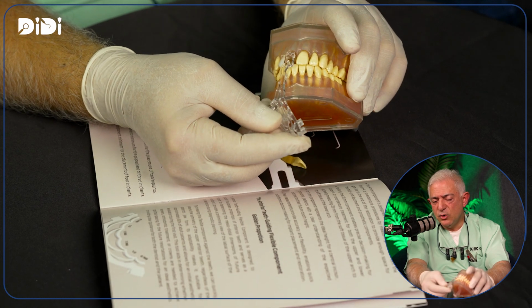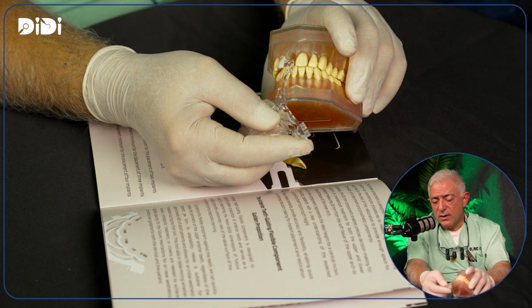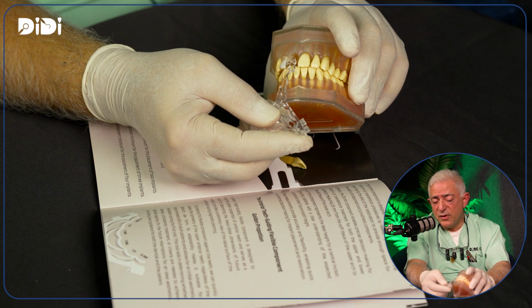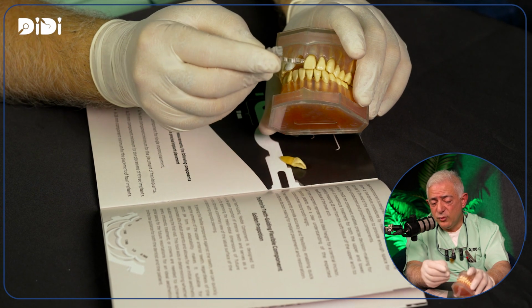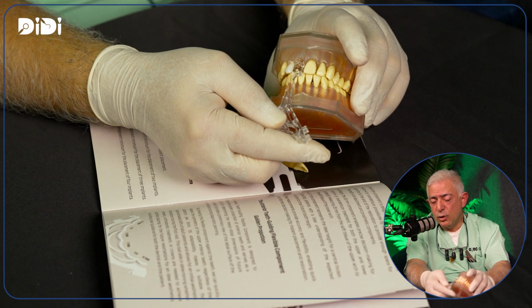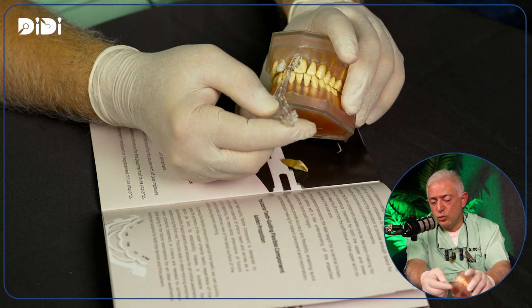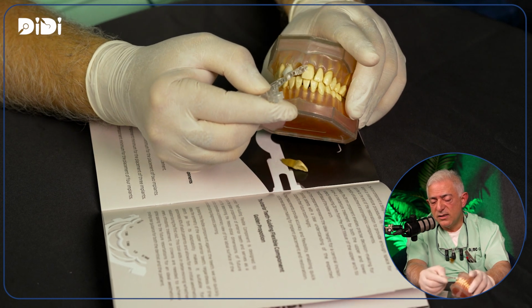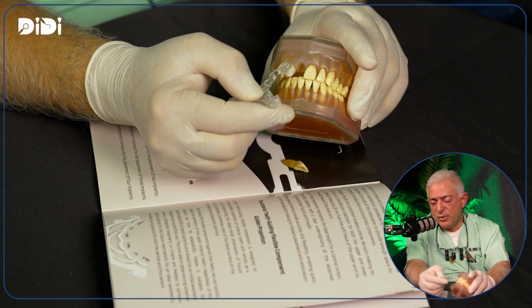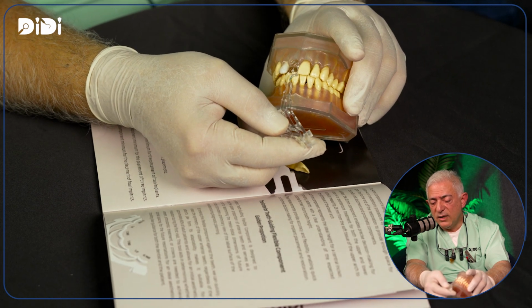And you measure. If it's 11, fine. But what if it's not 11? Then you can tell the patient in the first visit, my dear, I have to raise the gingiva here to make the tooth look aesthetic. And if the neighboring tooth is looking too long or too short, then you can suggest gingivoplasty or any procedure, because ultimately you want your crown to look natural.